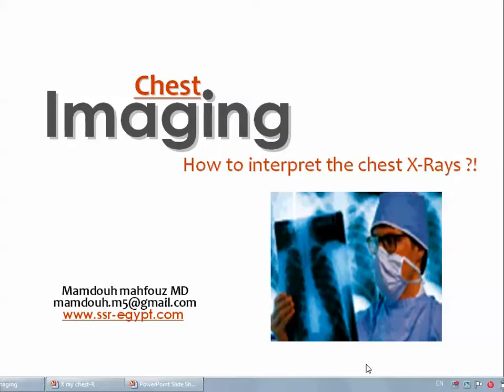Now we'll start the sector of chest imaging, and it contains about 11 lectures. We will cover through these lectures most of the issues concerning thoracic pathology. And we start with one of the most important lectures at all in the radiology specialty, which is how to interpret the chest x-rays.